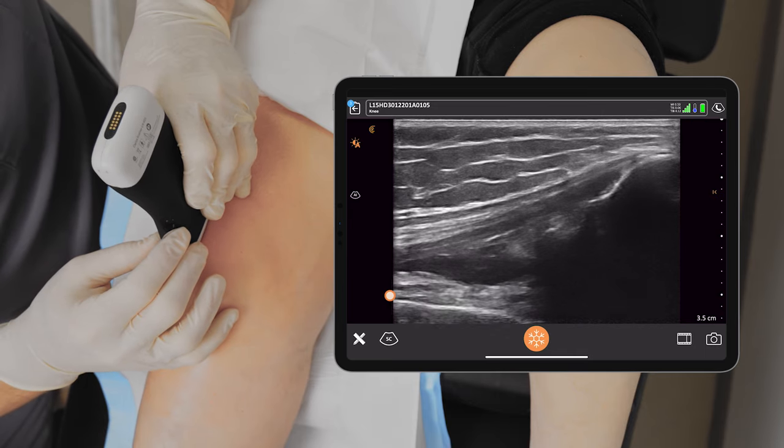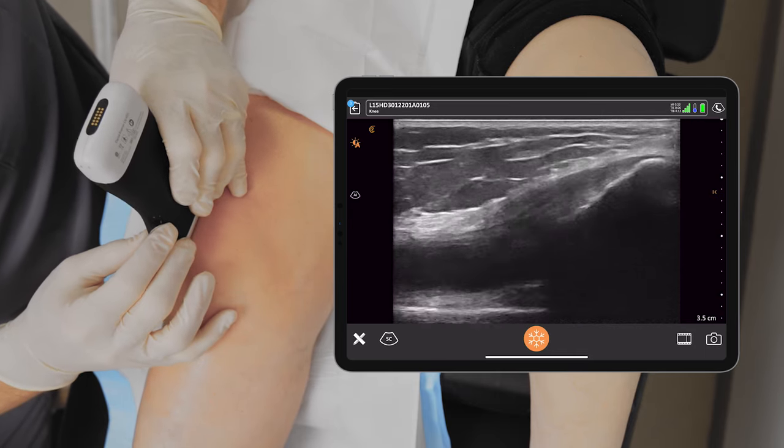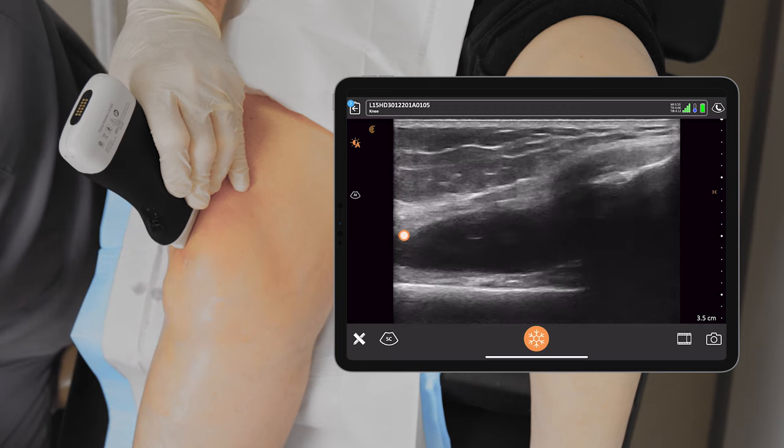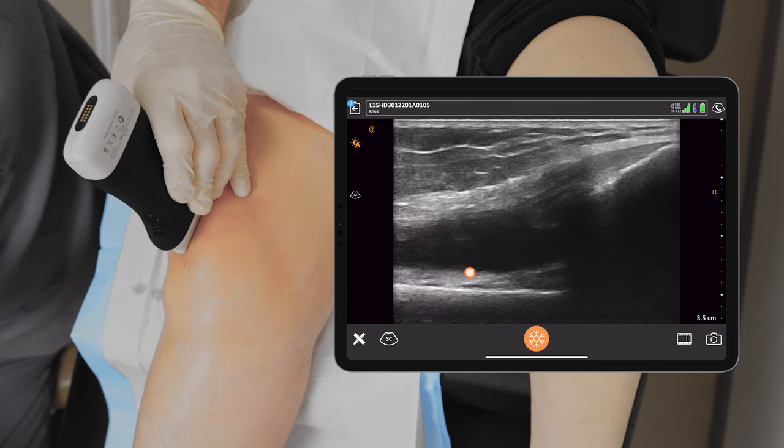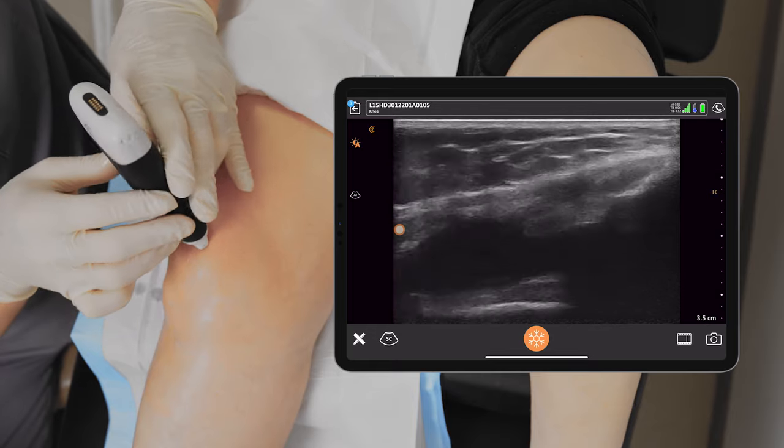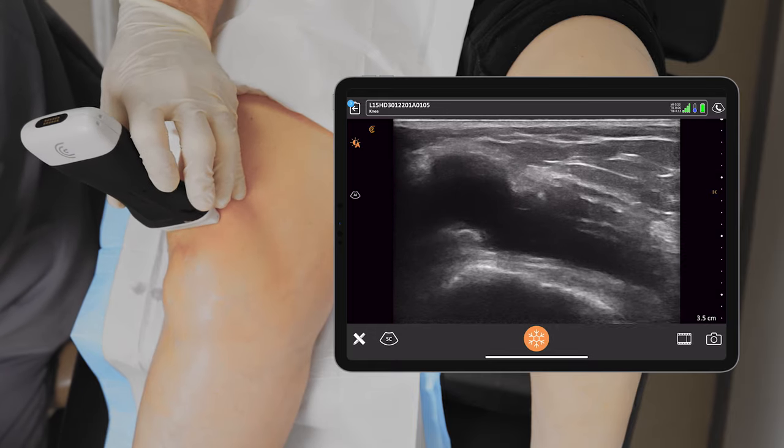If I slide my probe to the lateral third of the patella, that's usually where the greatest amount of effusion is. I'll then rotate the probe 90 degrees and we can see the effusion there.